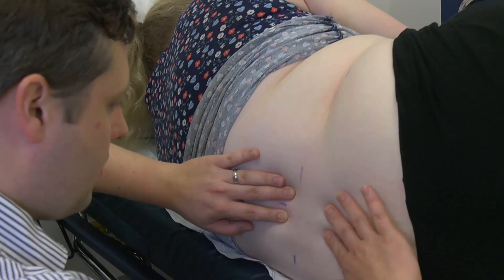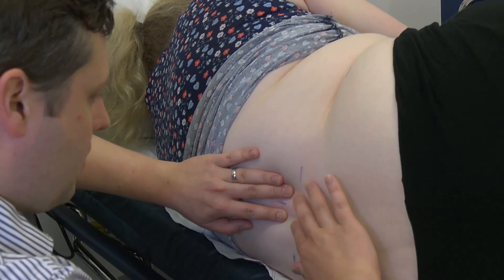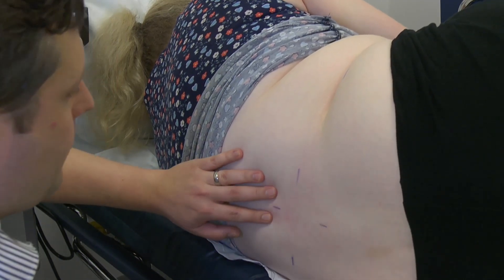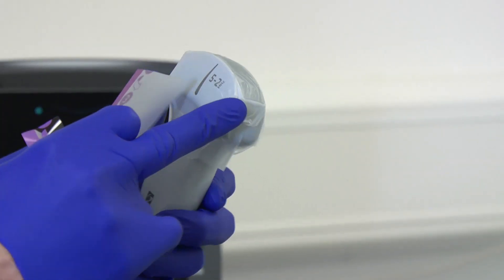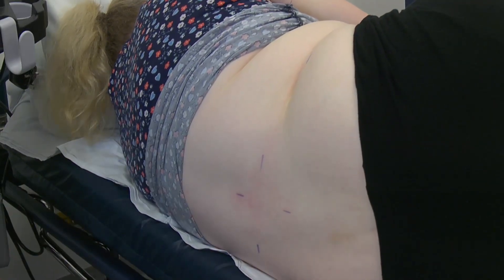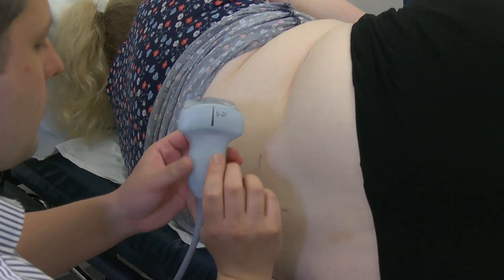Patient positioning is the same as for the landmark technique. Place a tegaderm on the ultrasound probe and apply plenty of gel. The probe is used with the mark uppermost, which corresponds to the mark on the screen.